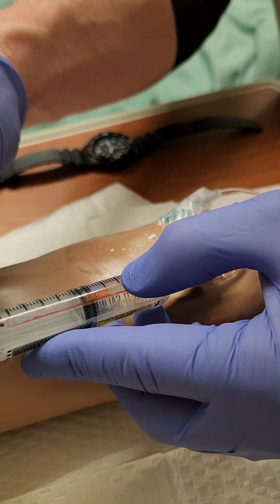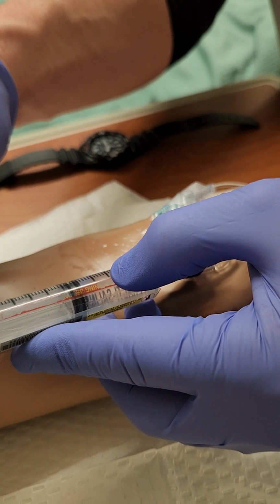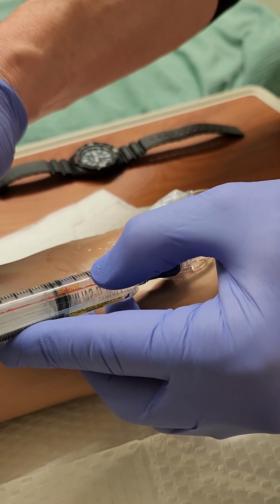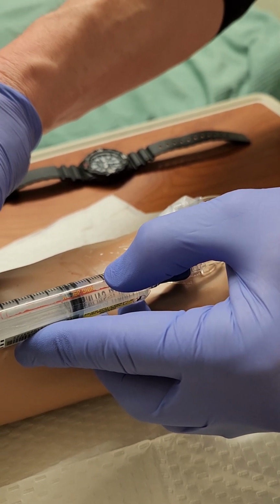How long will we be giving this one for? 4 to 5 minutes. Yeah, just gotta be patient. You can't rush a good thing, man. Can't rush a good thing.